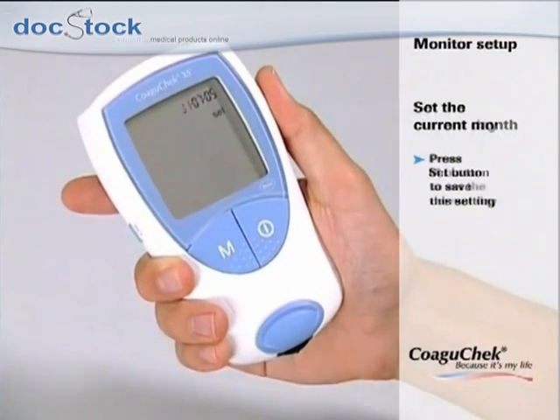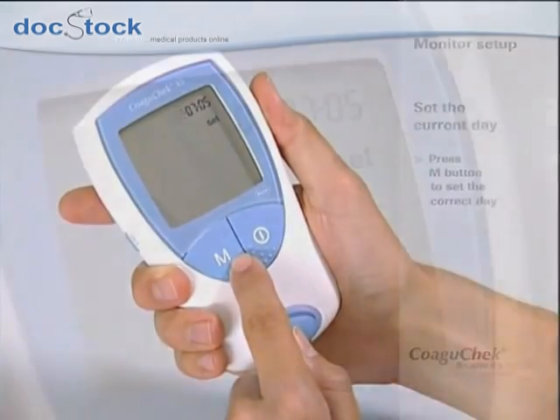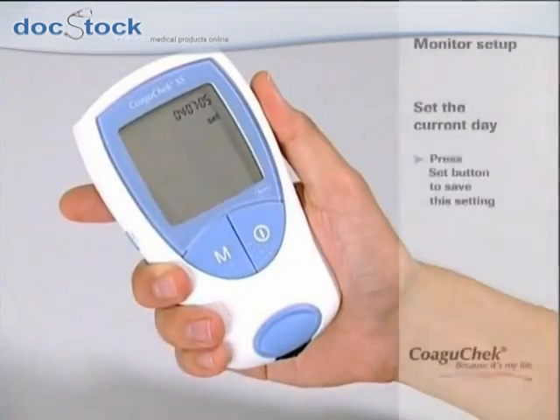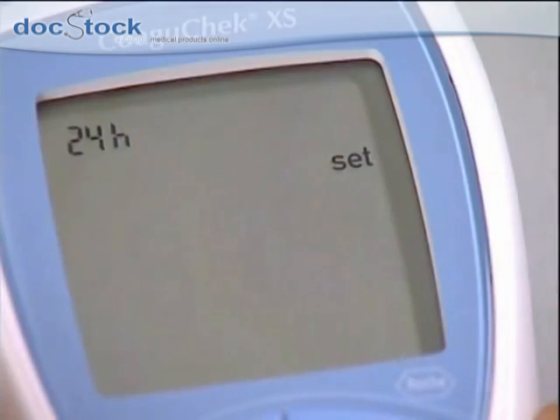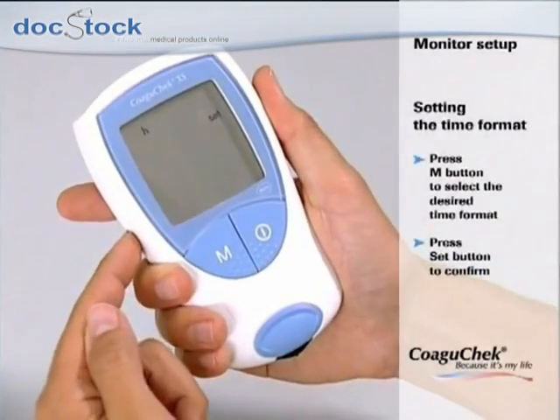The final step is to set the current day. Press the M button to change the flashing number until the correct day is displayed, and save the correct day by pressing the set button. The display now changes automatically to the time format setting — press the set button to confirm the desired format.